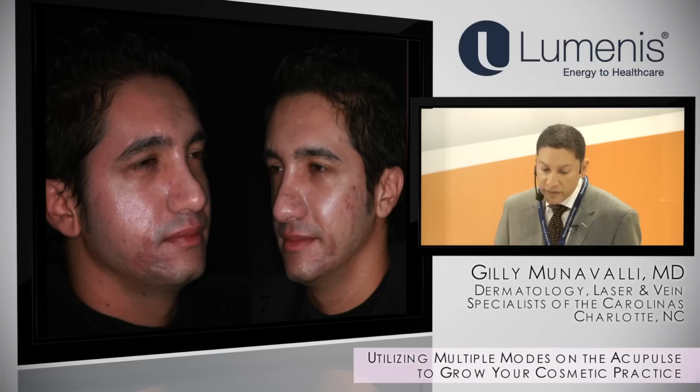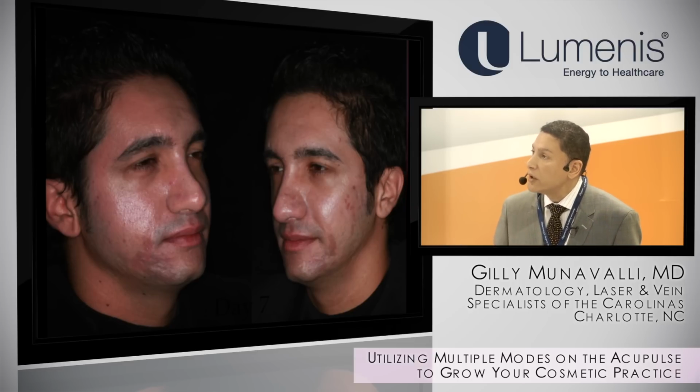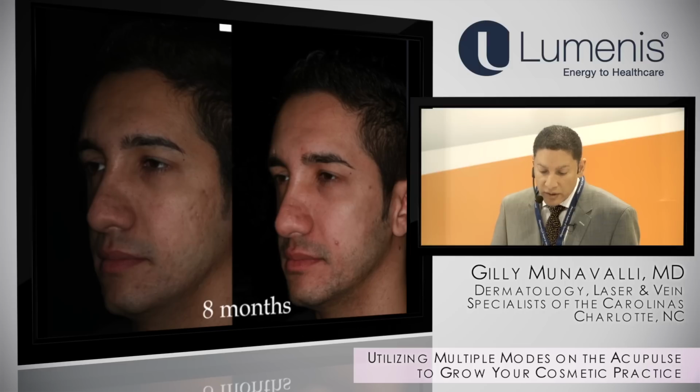Here's the deep areas. And then, of course, you have to deal with the downtime. You have to explain to patients that there's more erythema, a little bit more of a reaction in the deep areas, and they're not going to heal synchronously. So you have a little bit delayed healing in the deeper components. And this is after several months, and then after 8 months. And when I show these pictures to patients, they're very impressed. This is reproducible with acne scarring on the other side. And then after 8 months as well. So you notice the residual erythema is gone, and the acne scarring is much improved.